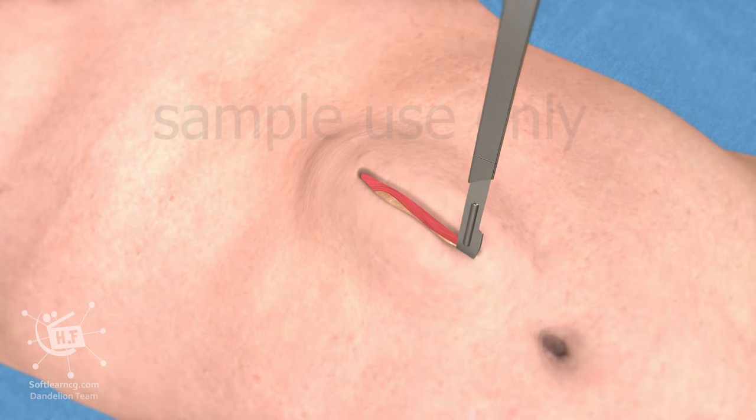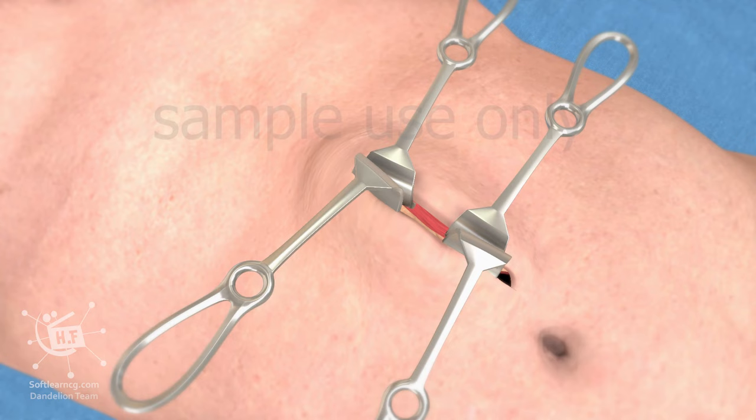Here we see this surgery being performed. Once the intestines are returned to the abdominal cavity, a surgical mesh is typically inserted within the surgical space.